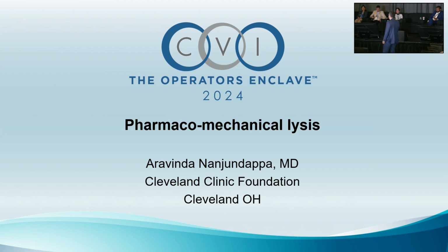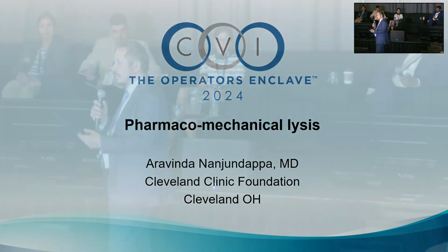No, definitely, and I think what I'm trying to point out is that we always forget taking a good history. History makes a huge difference. And even sometimes with a self-expanding stent that's not a covered stent, if the patient said, I was walking fine until 2 weeks ago, and now I can't walk, that's an acute occlusion. But with Viabahn, it's more likely than not a thrombus. So the one thing you're not supposed to do is just a balloon. Go ahead, sir.